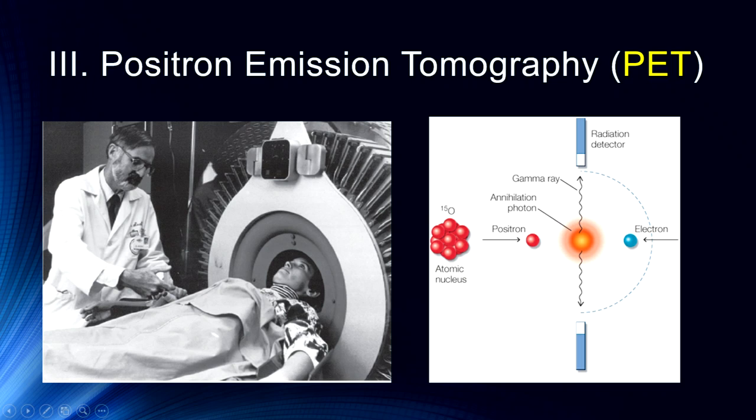And essentially, PET scans, as it says, stands for positron emission tomography. So we are imaging these positrons that are emitted by radioligands. And essentially, what happens is a radioactive chemical is injected into a participant. It's a mild dose of radiation. It's about what you might get in a transatlantic flight. For those of you who don't know, when you fly at very high altitudes, as you do when you're flying, say, to Europe, there's a great deal of cosmic radiation involved in that, and that's about the dose you get when you are in a PET scanner.